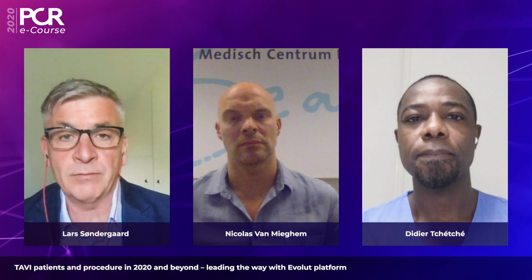Surgeons are putting these bioprosthetic valves into much younger patients, probably driven by the patient not wanting to go on anticoagulation therapy, and also by the idea that when this surgical valve is going to fail, you can just do a valve-in-valve procedure and put a TAVI valve into it. But I think we certainly need to take that into consideration when we treat these patients with longer life expectancy at a younger age, that if you start with a bioprosthetic aortic valve, it's going to have a relatively shorter durability than if you use them in the elderly patients we have treated so far.